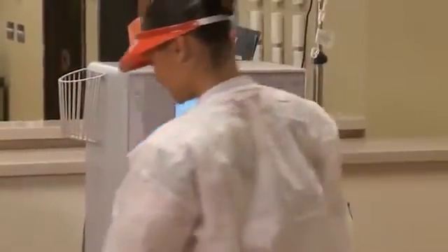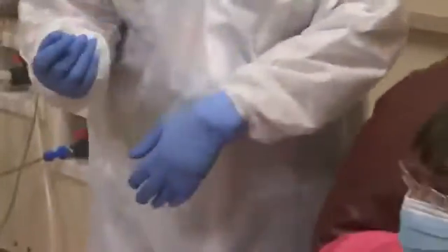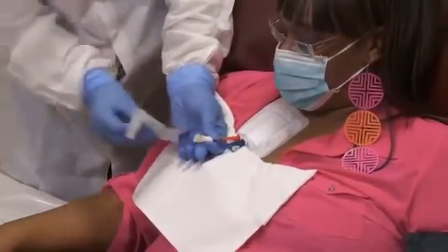To properly perform a catheter scrub the hub procedure during connection, use the following steps. Put on a gown and a face shield. Use a mask if required by facility policy. Perform hand hygiene and put on a new clean pair of gloves. Some centers may choose to use sterile gloves. Make sure to clamp both limbs of the catheter to prevent an air embolus.